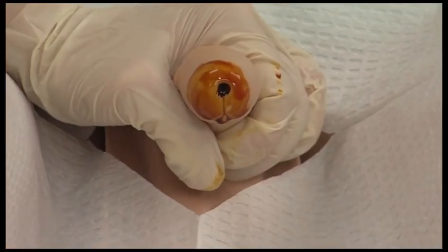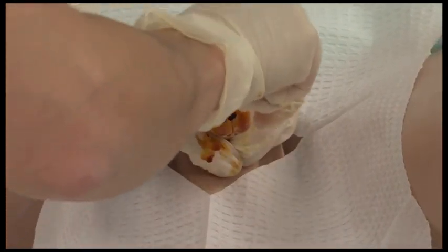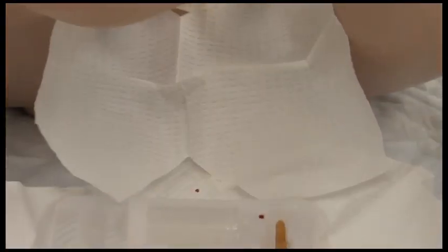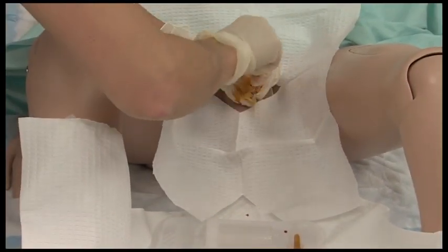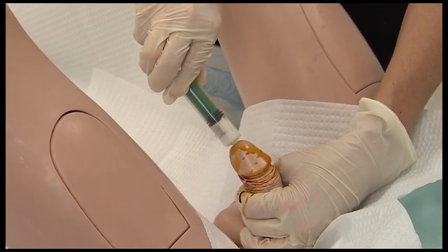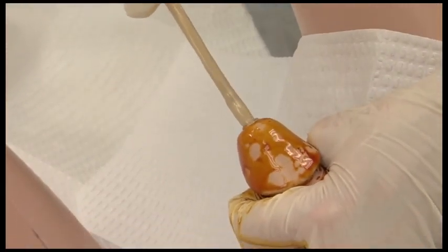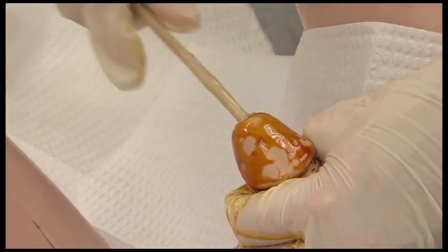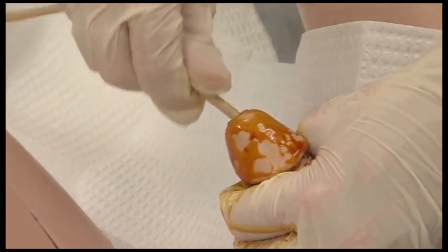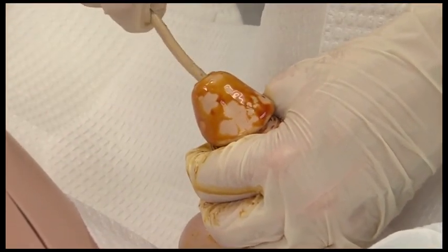With the pre-saturated povidone iodine swab sticks, cleanse the penis in a circular motion, starting at the urethral meatus and working outward. Use all 3 pre-saturated swab sticks. If hospital policy permits, or following physician's orders, inject remaining lubricant into the urethra per established protocol. Remove the catheter from the lubricant. Insert the Foley catheter into the urethral meatus, using gentle downward pressure. Insertion may be eased by instructing the patient to take deep breaths and exhale slowly.